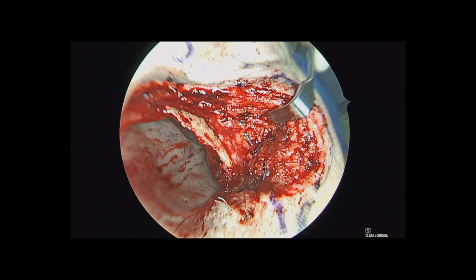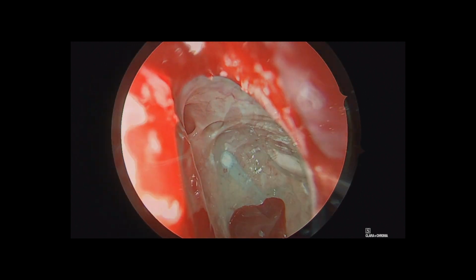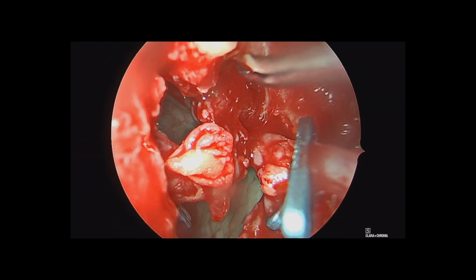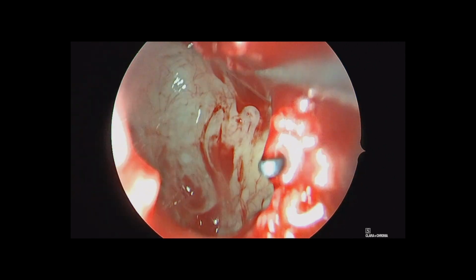As you can see here, the primary malignancy has been resected, and here we are working on the infraorbital nerve as it exits into the soft tissue of the skin. We will mobilize that from the skin defect directly into the maxillary sinus in a transmaxillary approach.